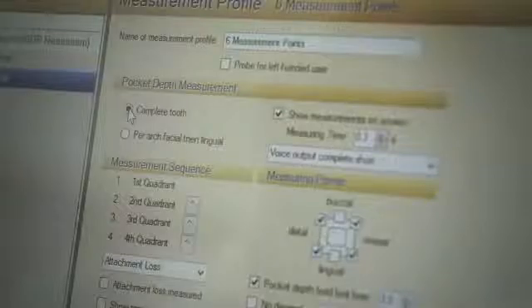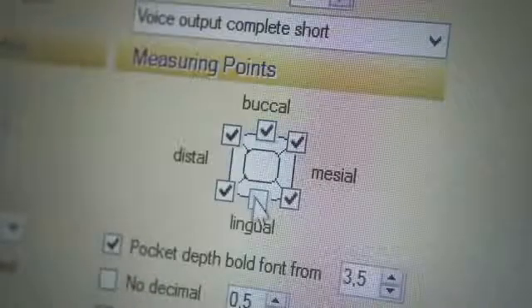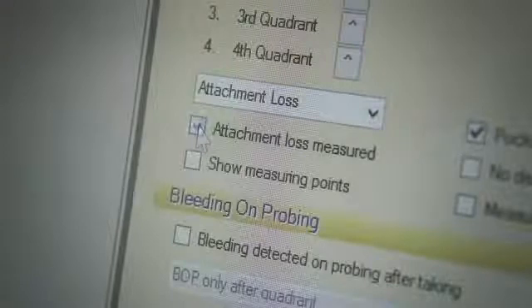With PAON you get standardized measurement results even between different dentists or hygienists. That's why you can easily delegate the measurement. You can follow your usual measurement procedure — with four or six measurement points per tooth, with or without bleeding index, and so on. You can set your personal measurement procedure in the software.